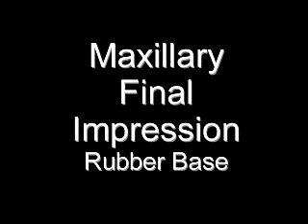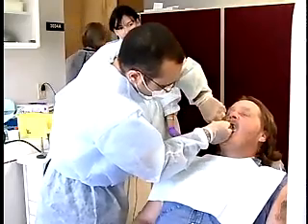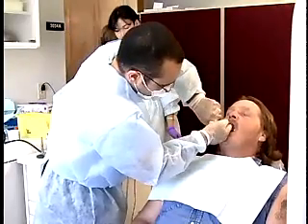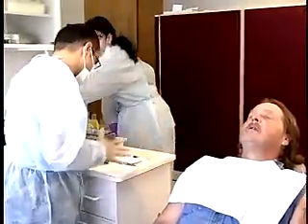Dry the palate and basal seat tissue with gauze. Have the patient close and retain the gauze in the mouth. Remember, over-drying the mouth will stimulate salivary flow.